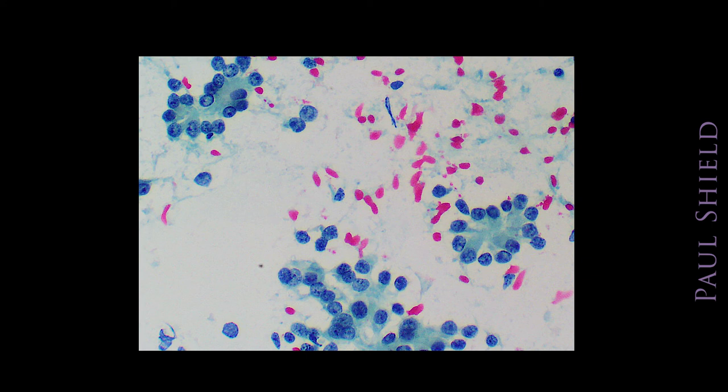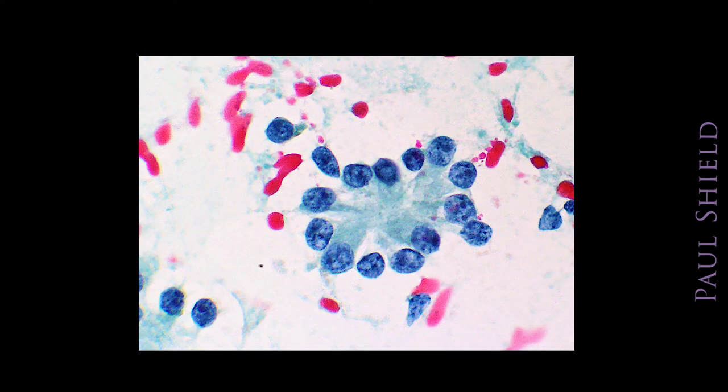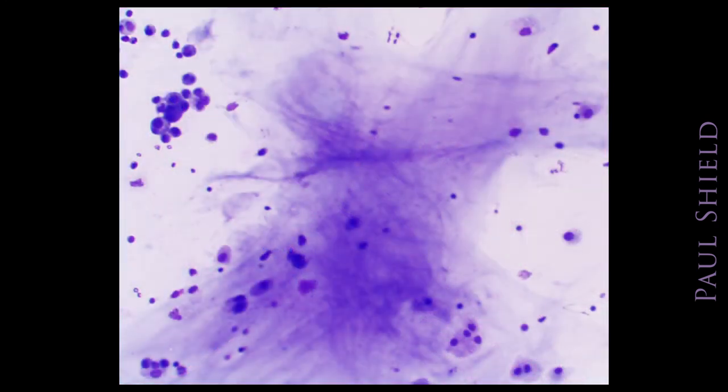Notice how the nuclei are all peripheral here, and then the apical edge of the cell is pointing into what would have been maybe a lumen. So the cells are trying to form a gland still. This is just an example of a massive overproduction of mucin that some well-differentiated adenocarcinomas produce, and you get a background heavily laden with mucin.